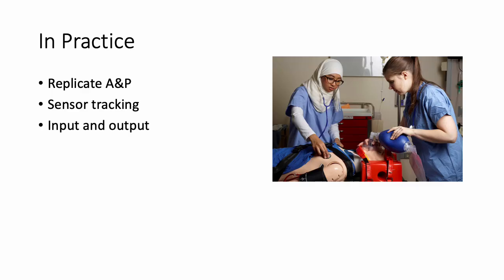Medical procedure simulators work in multiple ways in practice. They replicate anatomy and physiology, modeling things like heart rate, blood pressure, and oxygenation. For example, if the patient is experiencing blood loss, the simulator will have decreased blood pressure and increased heart rate. These simulators can simulate pulses, blood flow, breathing, voice, and airway sounds.